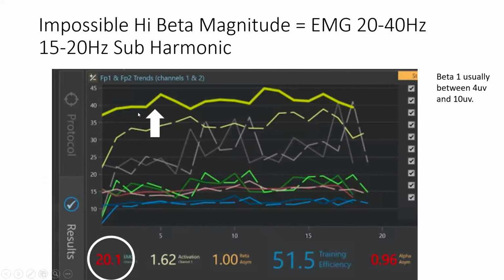Now what's interesting here is notice that the red line is down here. Now in the BrainMaster software that I used, and I use that the most, but I also use Thought Tech, you generally see the beta and the high beta move together, not always, but that's because different software developers use different frequency ranges to capture beta, high beta, and EMG. Some of them don't even put EMG in. So sometimes these generally move together, but sometimes they don't, and that's an indicator that it is coming from a specific muscle group.